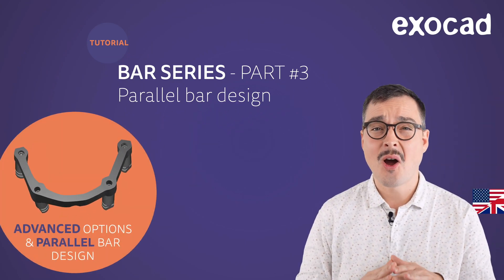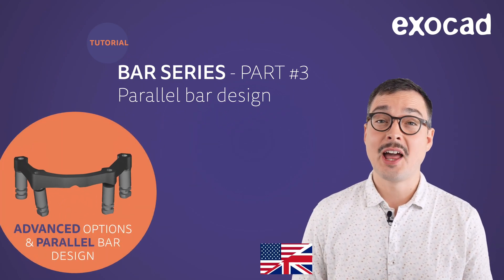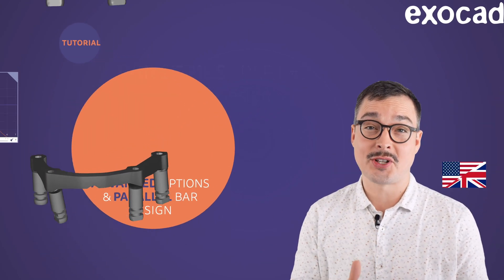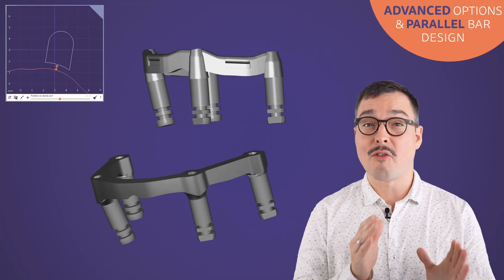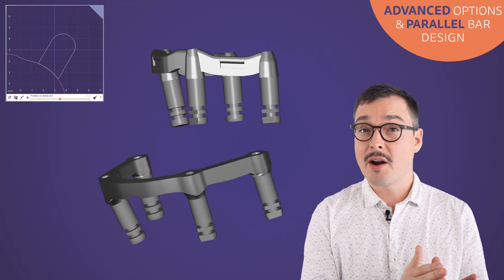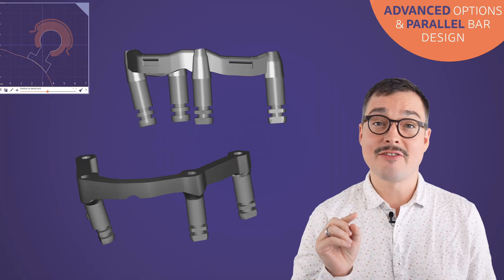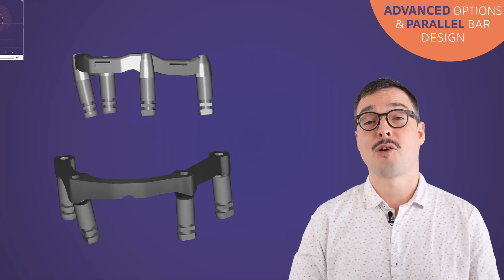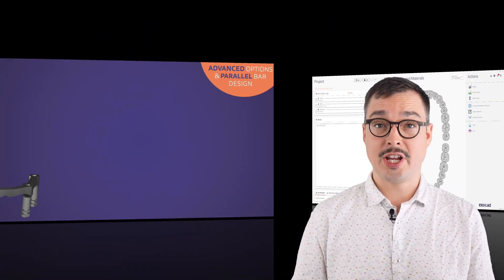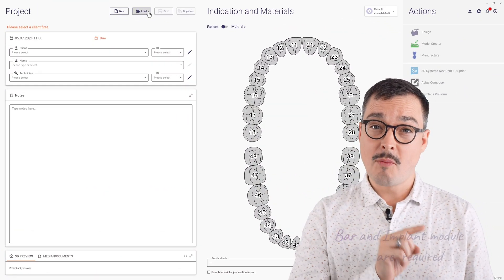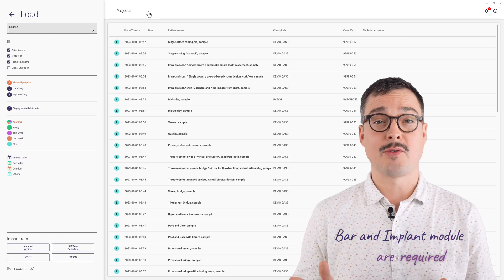Hello, I'm Clemens from ExoCAD. Welcome to this video tutorial, which continues our bar series with a step-by-step design of a parallel bar with optional Preci-Horix and a deep dive in advanced profile editing. To achieve the workflow shown in this video, the bar and implant module are required.